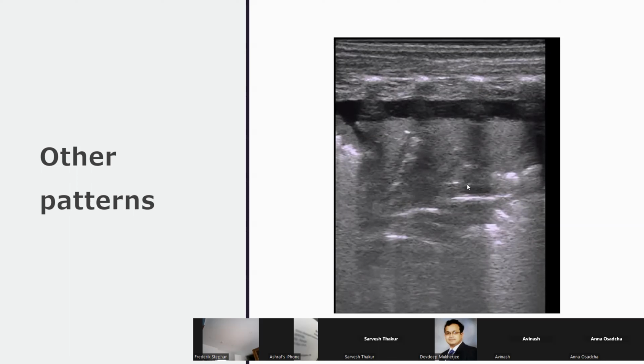But more importantly, why you also have to be very cautious is you've got a significant pleural effusion which is causing compressive atelectasis. And if it's compressive atelectasis, really, this may or may not be a recruitable lung. So again, it's having that thought process of going through that protocol that we're going to talk about. This is clearly lung that looks like atelectasis that might be recruitable based on this pattern, but it also has a significant effusion, and that significant effusion might cause problems with your ability to recruit that focal area of lung.